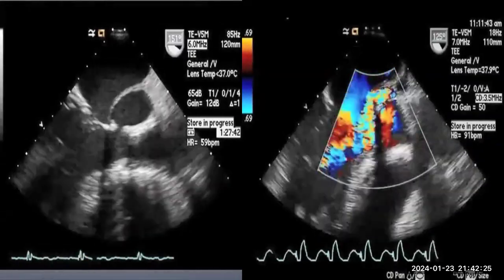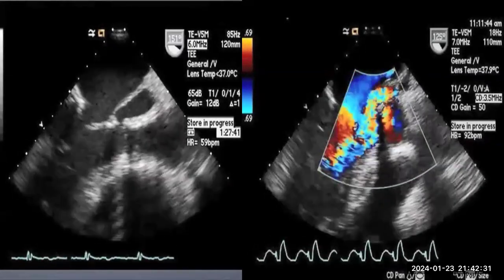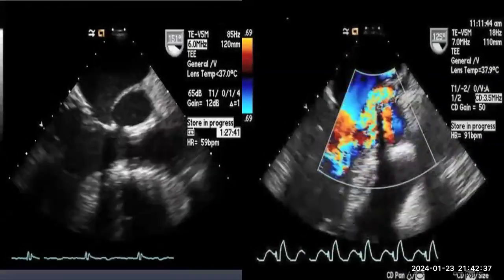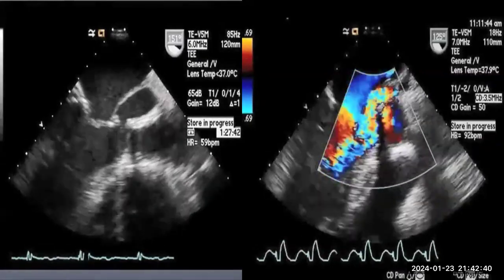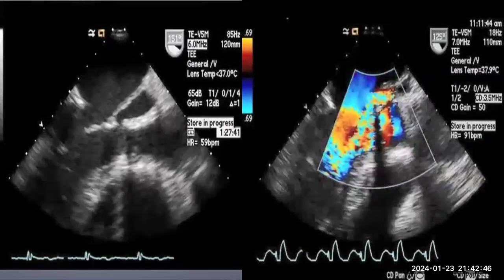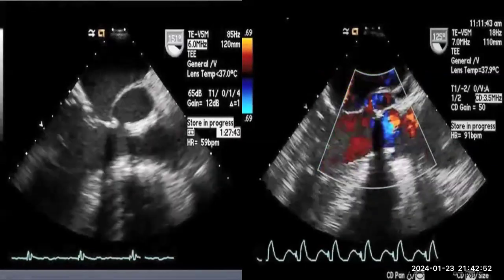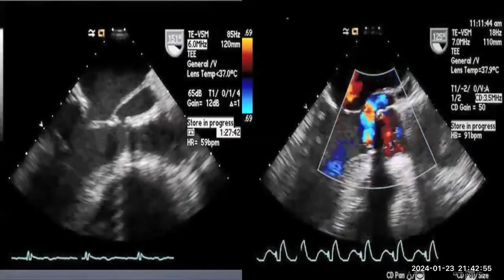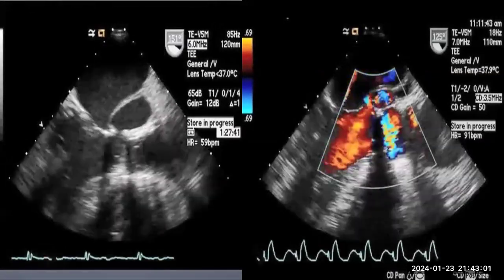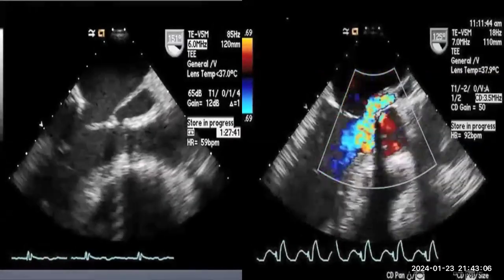Yes, this is a dehiscence. The rocking, sometimes the movement of the valve will be more ugly and more significant, but you can say this is a dehiscence. Definitely, this is a dehiscence of the valve in the presence of this fistulation or pseudoaneurysm or whatever it is. So this is a case of infective endocarditis. Yes, endocarditis. So you can choose all the findings in the prosthetic valve downstairs. You have pathological regurgitation, dehiscence, endocarditis. So this is a case of infective endocarditis with abscess formation of the bioprosthetic aortic valve. يعطيك العافية فهمت. الله يعافيك.